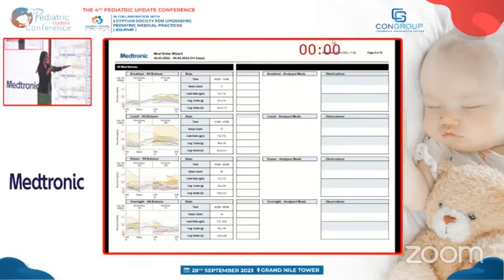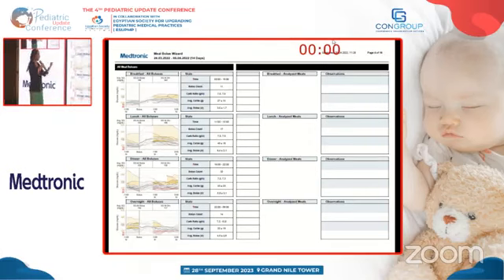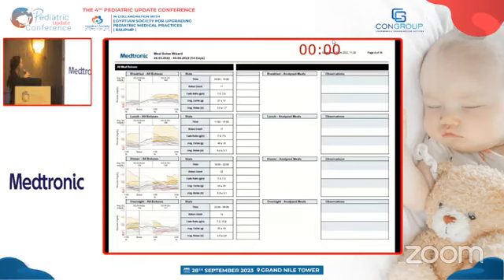وبعد كده بعد لما بناخد الجرعة ده وقت الميل بولس، بعدها اللي بيحصل إني بلاقي بعد كده عندي إنكريز في القرايات بتاعتي. فده هنا اللي بيقول لي إني هبص على كارب كاونتنج فيرست، بعد كده لو مظبوط تاني حاجة هبص على الكارب ريشيو بتاعي، ممكن إنه محتاج أدجستمنت إني أغيره. هنا بعد كده لو نزلت على البولس اللي بعدها، الرؤية هنا تمام.